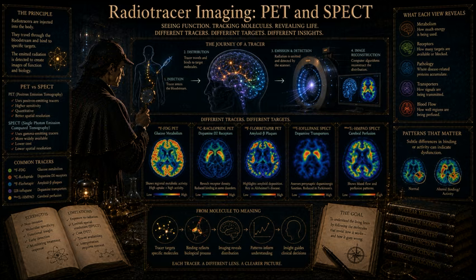Then those 16 are pulled to a third dynode. It creates a cascading, exponential avalanche of electrons. Oh. By the time that electron stream reaches the final anode at the end of the tube, the signal from that original single photon has been amplified millions of times into a highly measurable, distinct electrical pulse.